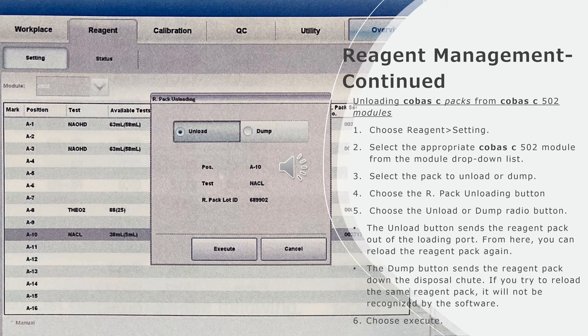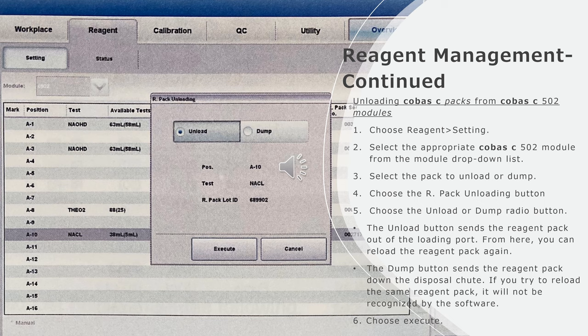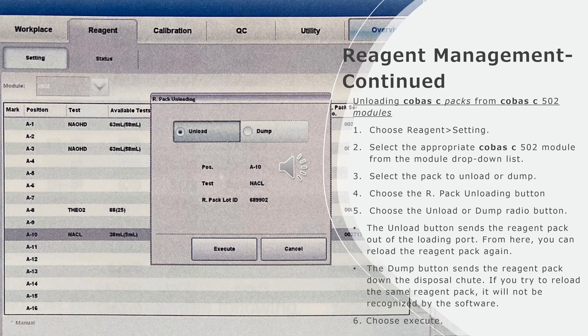Unloading Cobas C packs from Cobas C502 modules: Choose reagent, setting, select the appropriate Cobas C502 module from the module drop-down list. Select the pack to unload or dump. Choose the R pack unloading button. Choose the unload or dump radio button.